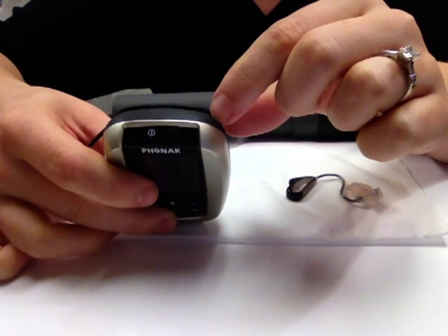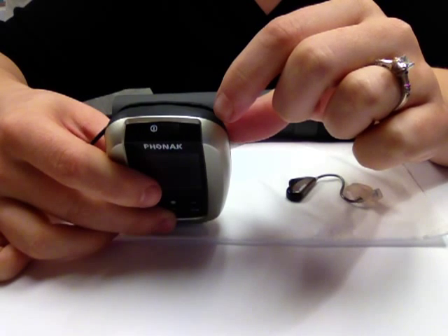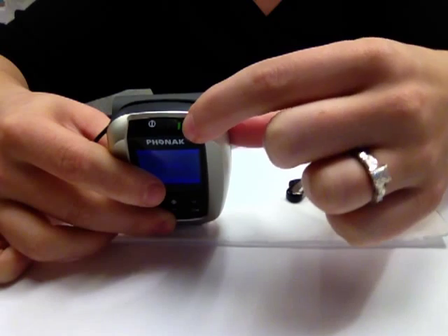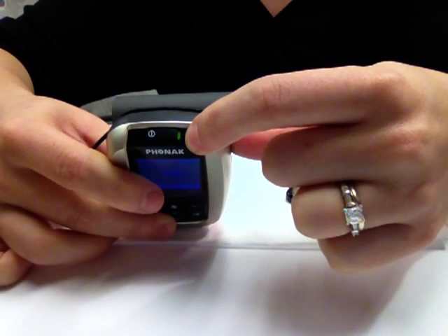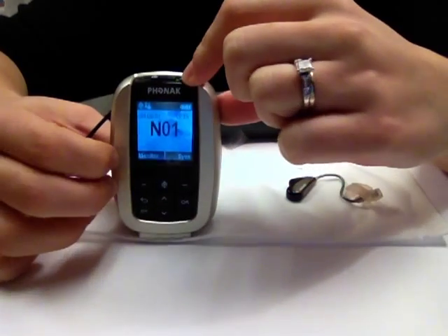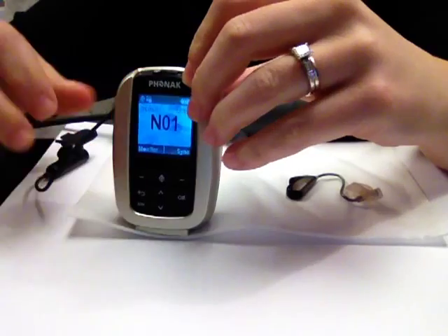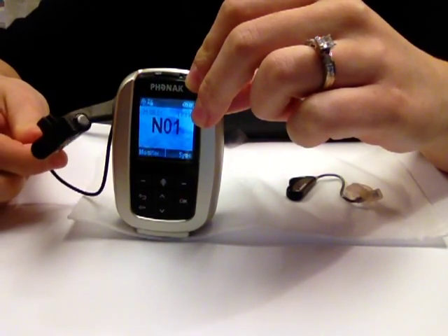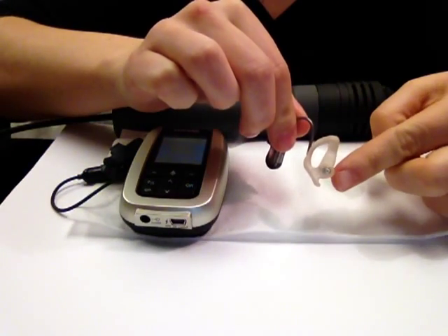To turn on the iSense transmitter, the Inspiro transmitter, you'll need to do this by pushing the slider on the top of the transmitter to the left. You will see the green color showing underneath the slider. You should hear 3 beeps, and then you should speak into the Inspiro transmitter's microphone. You should be able to hear yourself through the iSense receiver. If you do, that's great. That means the iSense is working.